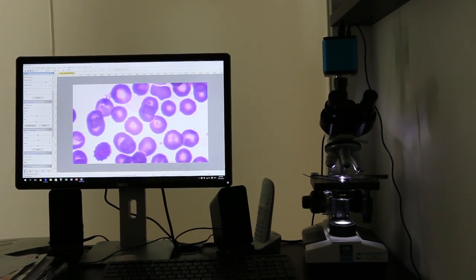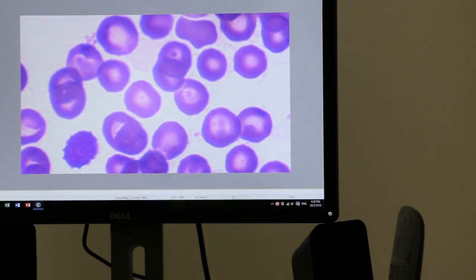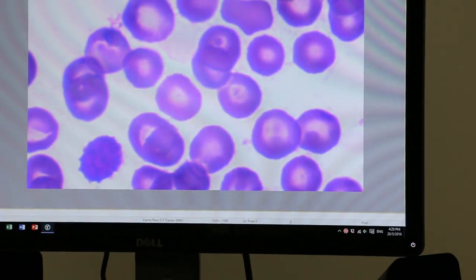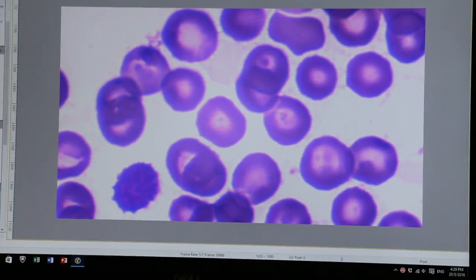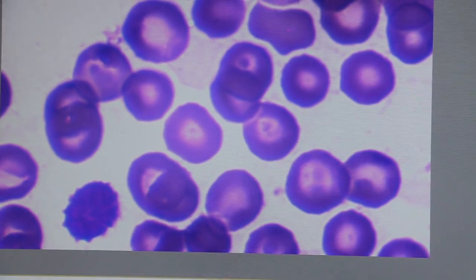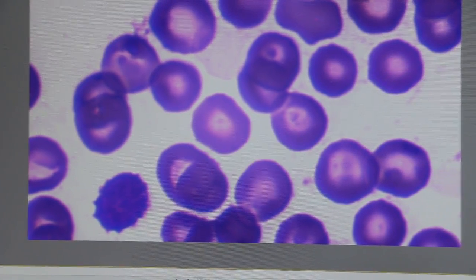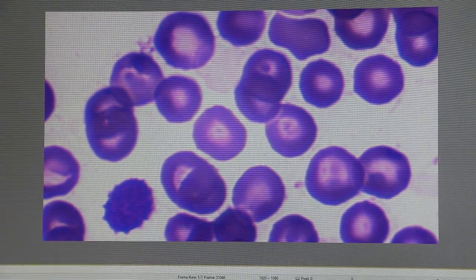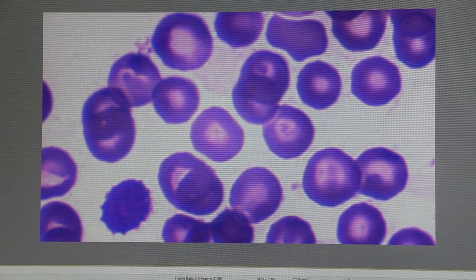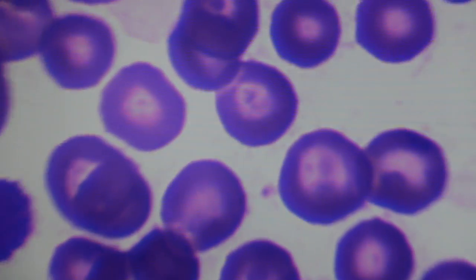Peripheral blood smear to check for Babesia canis, as you can see, in this dog with thrombocytopenia and anemia, called Maximus. This dog, a 12-year-old poodle, went to the first vet who took a PCR test and a peripheral blood smear, and there were no parasites in the red blood cells at that time.